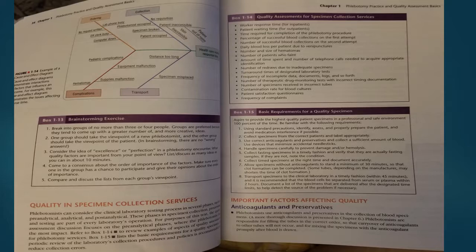8, transport specimens to the clinical laboratory in a timely fashion, within 45 minutes, and it is recommended that blood cells be separated from serum or plasma within 2 hours. Document a list of specimens that are delivered after the designated time limits to help detect the source of the problem if necessary. Important factors affecting quality: anticoagulants and preservatives.